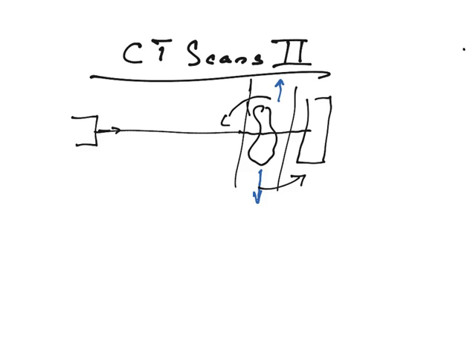But it was, of course, inefficient, took a long time for images to be produced, and, of course, for the computers to do their work. Now, they were able to increase the efficiency with the filtered back projection and things like this. And they finally had their first generation actual machines. So for the first generation, what you would have is a machine basically that could image the brain. That's pretty much what it was good for.